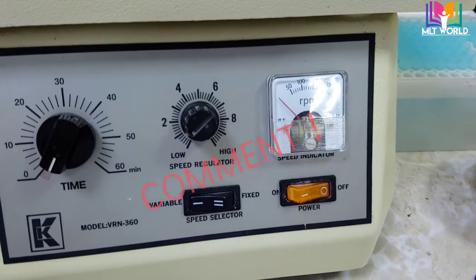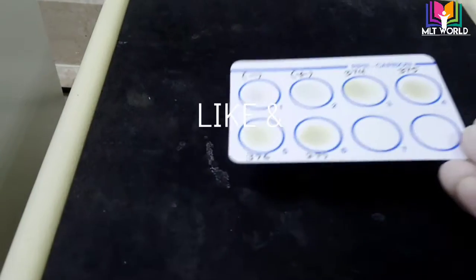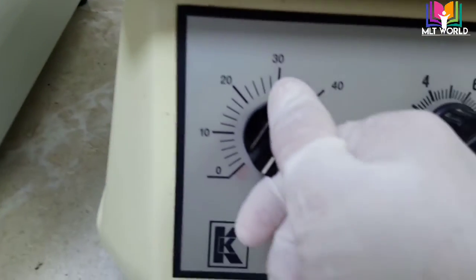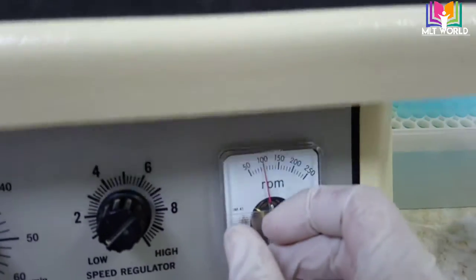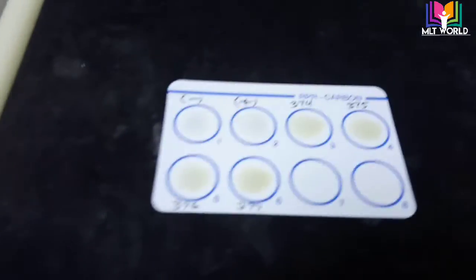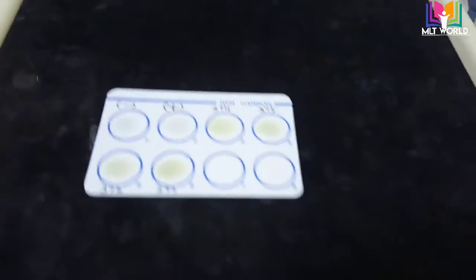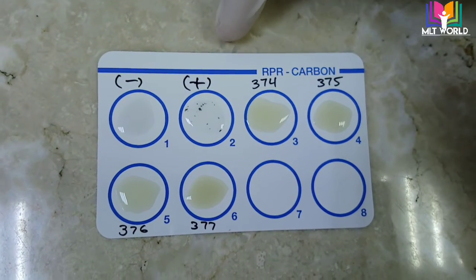Now we will place the card in the rotor. We will set the rotor speed to 100 rpm for 8 minutes. Set the time and confirm the speed is 100 rpm. After 8 minutes we will check the result. You can also rotate by hand, but if a rotor is available, prefer using the rotor.